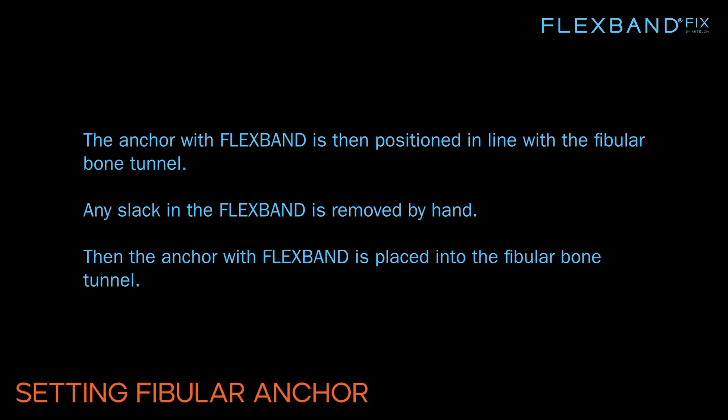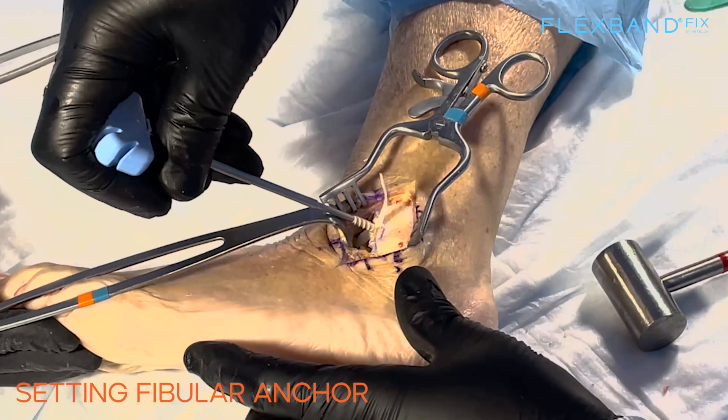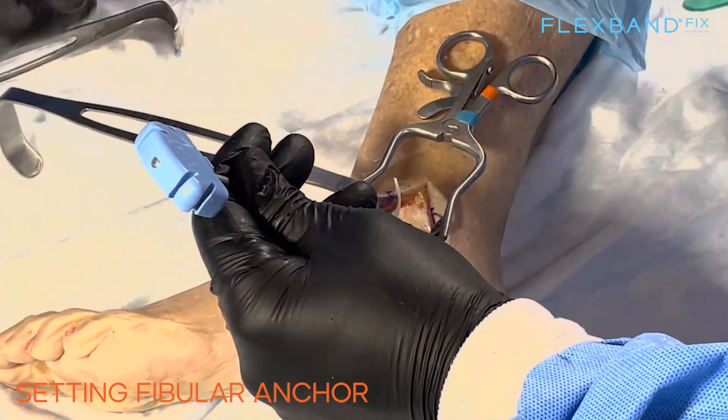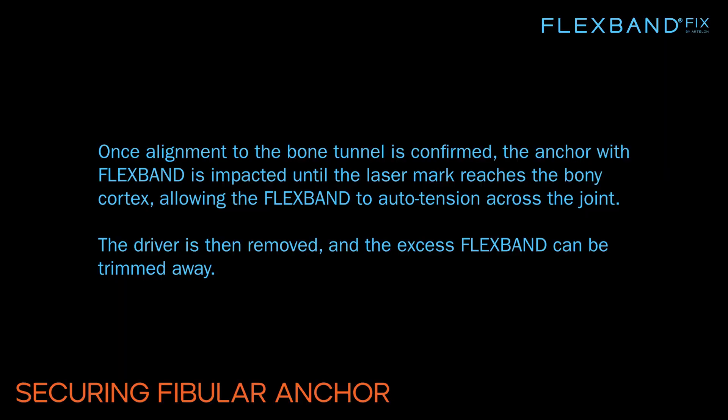The anchor with FlexBand is positioned in line with the fibular bone tunnel. Any slack in the FlexBand is removed by hand, then the anchor is placed into the fibular bone tunnel. Once alignment is confirmed, the anchor is impacted until the laser mark reaches the bony cortex, allowing the FlexBand to auto-tension across the joint. The driver is then removed and the excess FlexBand is trimmed away.